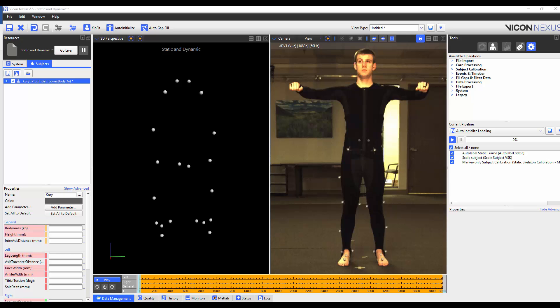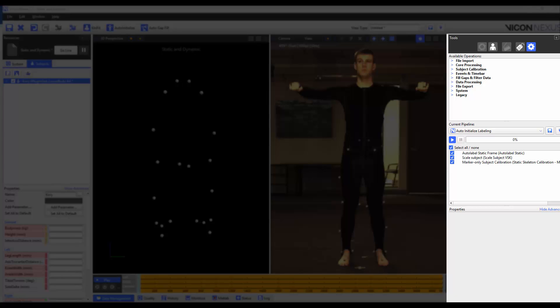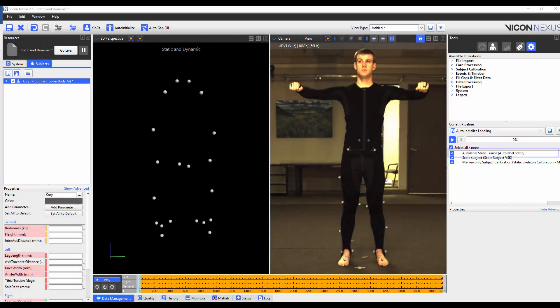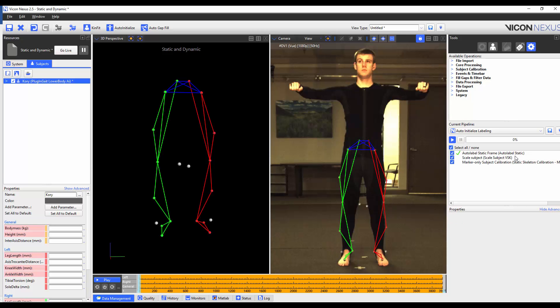The next step in the process is to calibrate the subject. To do this I'm going to make sure that I'm on a frame where my subject is standing in the base pose. I'm then going to make sure that I'm in the tools pane pipelines tab and to make sure that the auto initialize labeling pipeline is loaded. The first operation is to auto label the static frame. Because we have extra markers this may not work and so I'm going to execute this operation by itself to make sure that all the markers are correctly labeled. I can already tell that my ankle markers have not been labeled correctly.